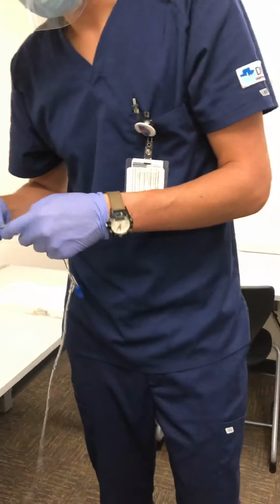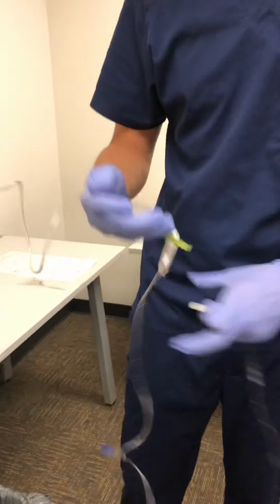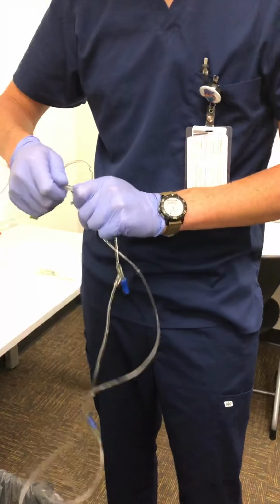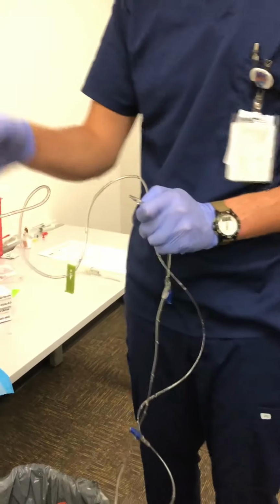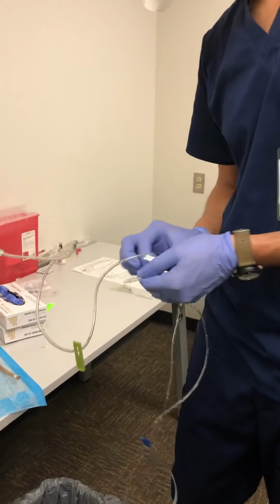And then once I'm ready for it to flow, I'll open up this end, making sure not to touch anything to keep it sterile. Set that up. Fill my drip chamber, and open up the flow.